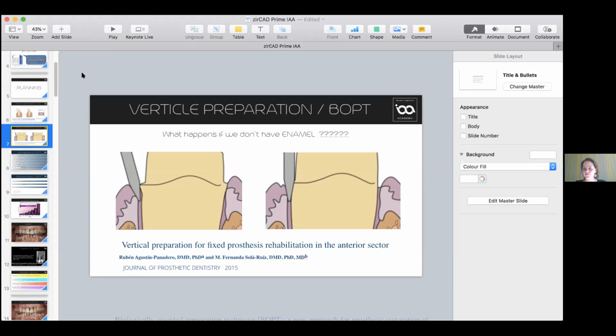And thirdly, if we're using a resin-modified glass ionomer, this is going to set on its own, and eventually we will remove the cement. This is what I've been doing for many, many years with any regular cement. It's accessible with a probe to clean because it's only 0.5 millimeter. So I'm not worried that I'm going to leave excess cement under the margins. The normal way would be with a probe, with floss, with all the things that we're used to in removing cement.